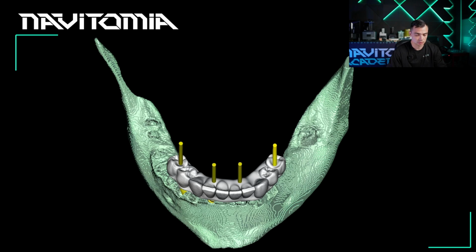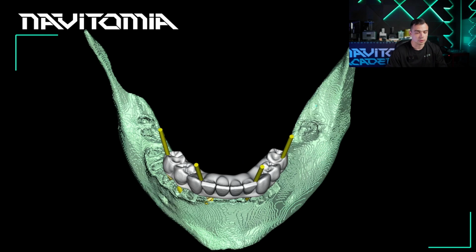Ideally, they must have 0 degrees between each other, but usually it's very hard to do, and sometimes we get a result like this. No, I'm kidding. Some small divergence of the axes can occur, it's possible, and most likely it will.